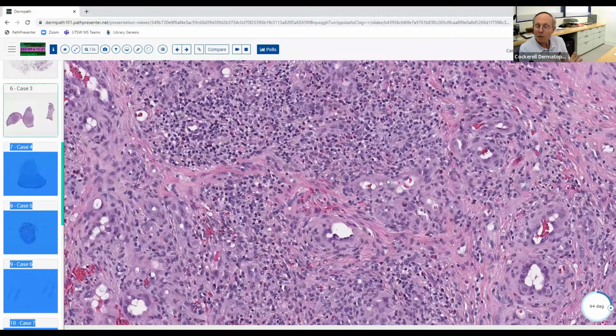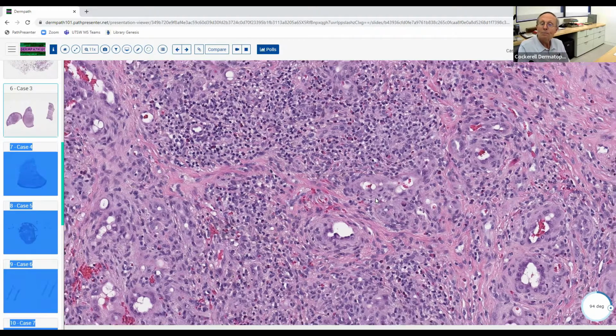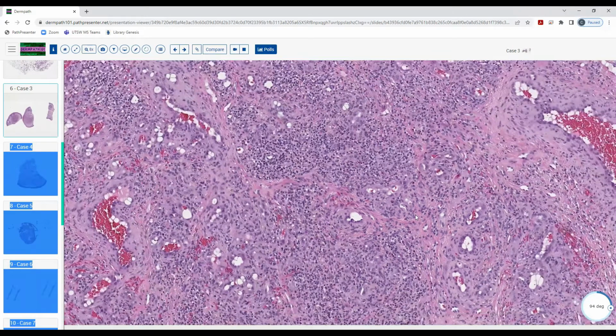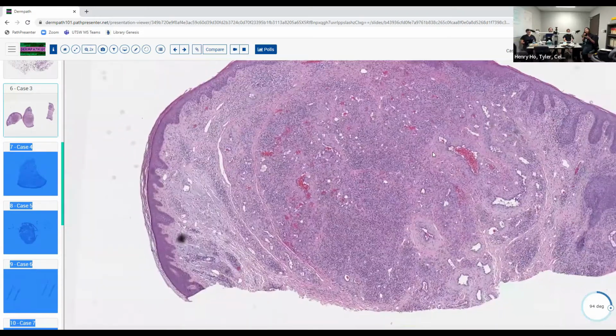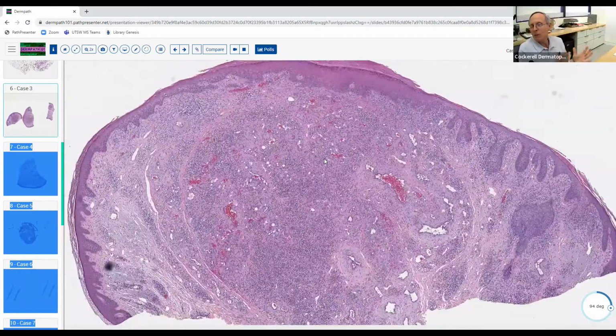So does anybody know a diagnosis where you see a vascular proliferation with these sort of thick wall blood vessels and the prominent endothelial cells associated with abundant eosinophils? Also sometimes even with circulating eosinophilia as well. What about polyarteritis nodosa? Yeah, you know, that's more of a vasculitis. So you can get a small vessel vasculitis, or a larger blood vessel vasculitis in the dermis with inflammation of all the blood vessels, neutrophils, those kind of changes. But here you've got eosinophils, and it almost looks like a lymphoid process with eosinophils. Are we talking about like Churg-Strauss? Well, that's also kind of a vasculitic condition.